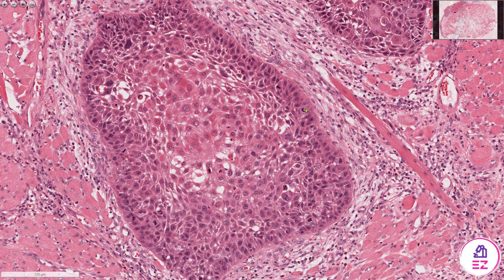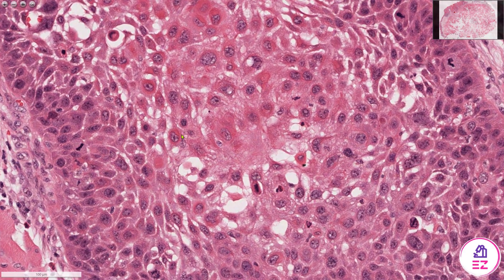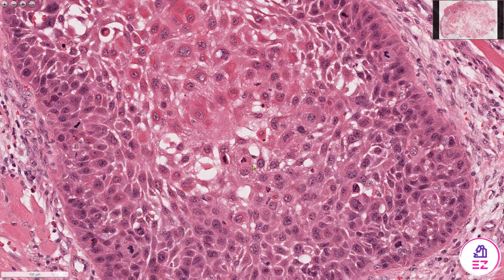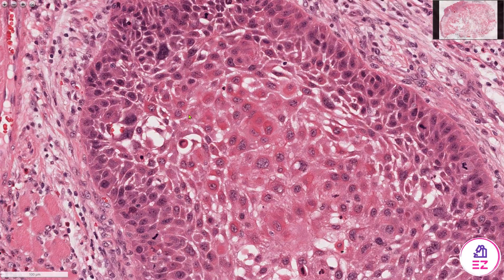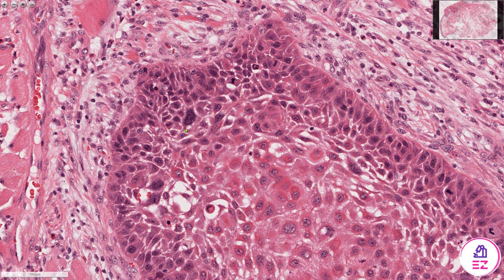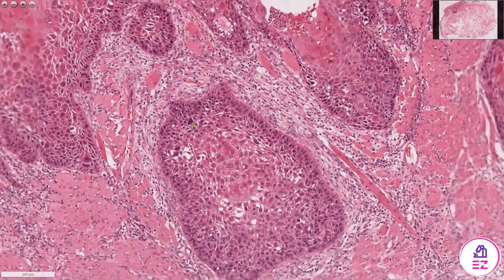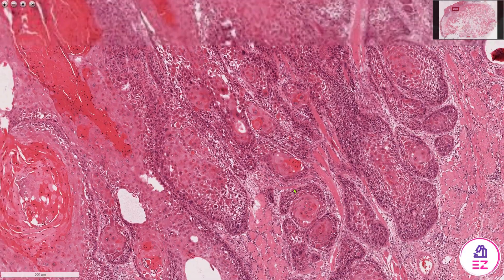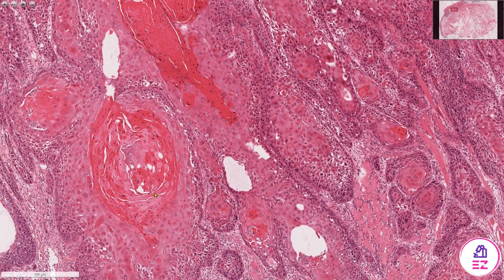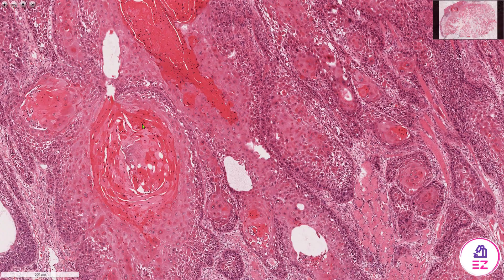I can see lots of mitoses. I can see that some of the cells have pink cytoplasm indicating dyskeratosis. There are also large cells with macronuclei, and some of them have very dark nuclei indicating hyperchromatism. These cells are also forming keratin pearls in places, and these are variable in size.